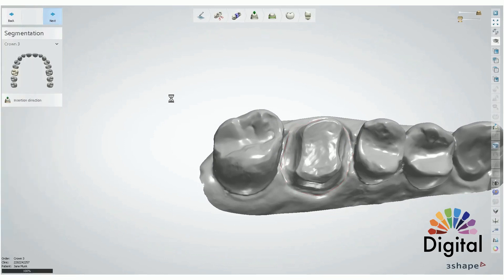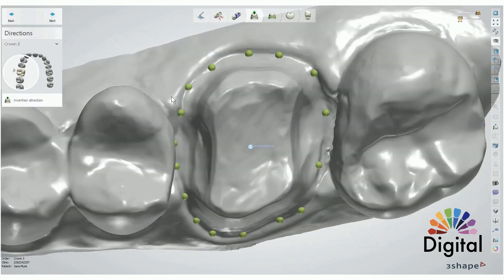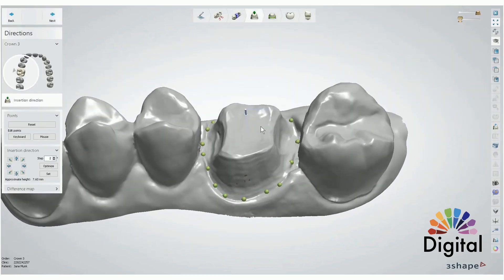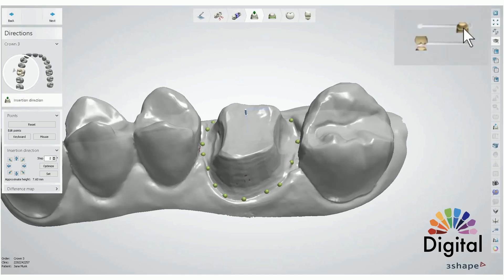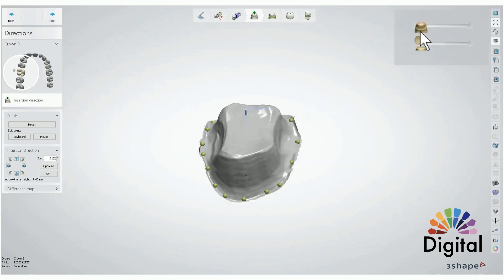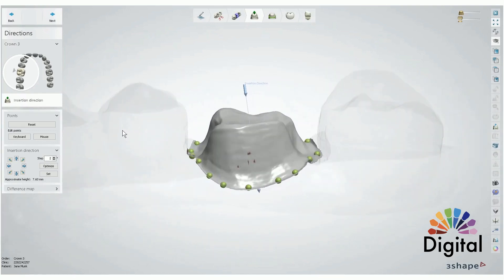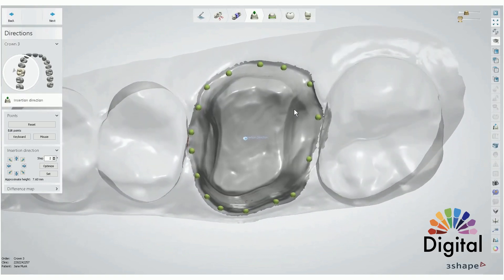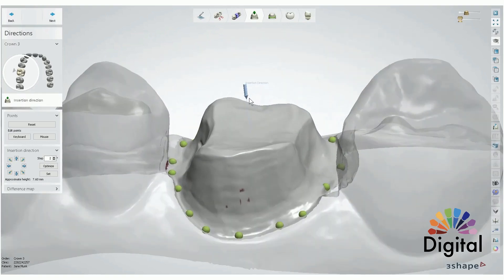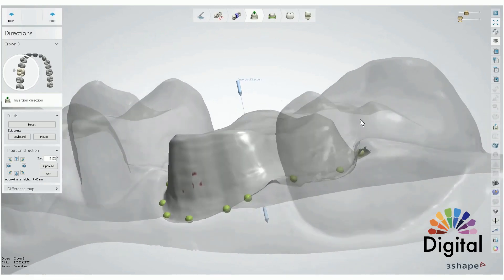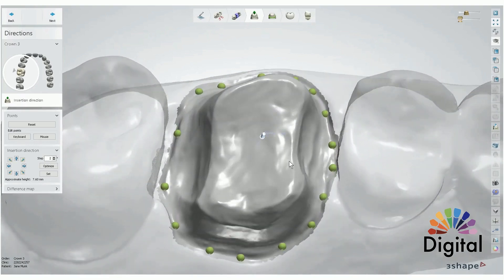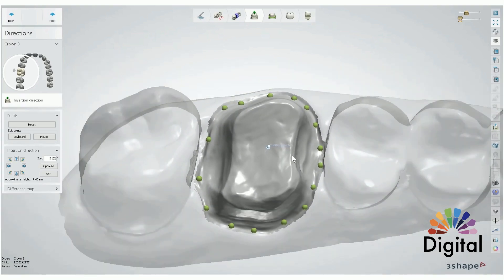Click next. Now we can see green dots on the margins. You can turn the arch skin on and off. So now we have the segmented tooth here. The reason we draw the segmentation line is so the dental system can create and detect the insertion path automatically with minimal undercut. Mostly for a single case, we don't need to change the setting of the insertion direction.